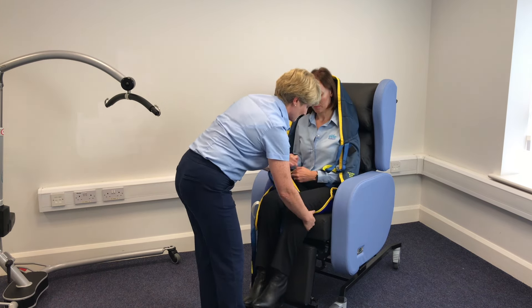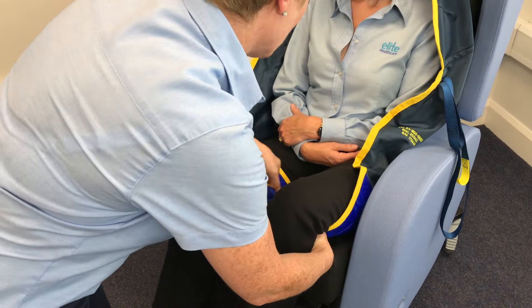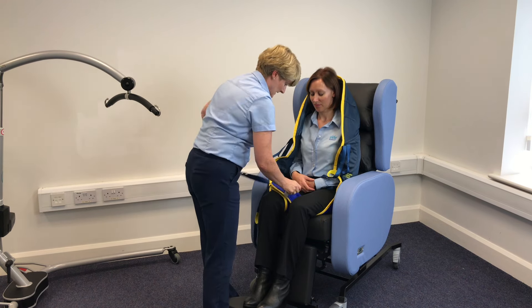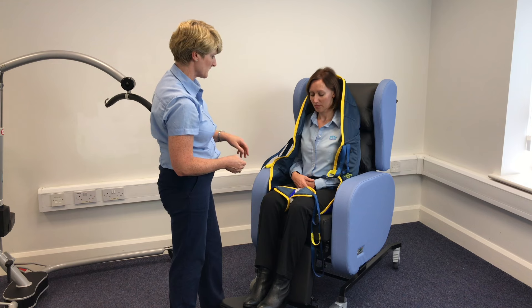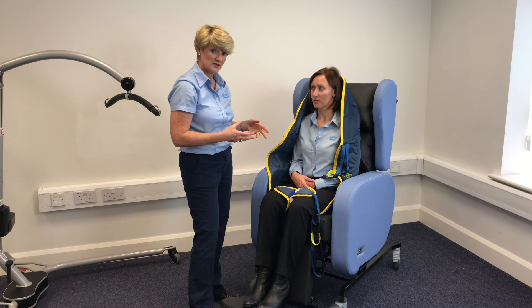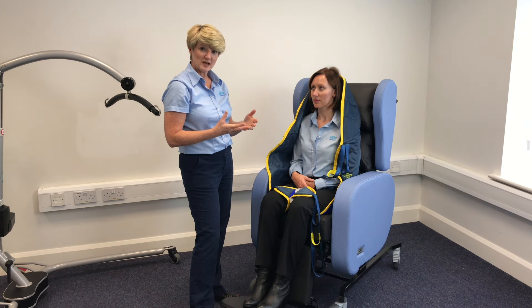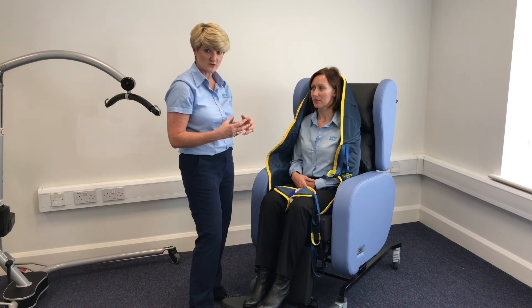Without having to do a major lift with Deirdre's legs, the leg piece just slides under. It is very important that the sling is on symmetrically, because if it's not, the patient is going to end up being twisted. I'm just going to put the leg piece through the modesty strap — if I don't, you end up with too much abduction in the hips, which is not a good idea. This particular sling is a looped system. I find looped systems a lot better, particularly for the complex patient — your patient with tight hamstrings, contracted legs, clients that are windswept, maybe bilateral amputees, and of course wriggling children. You have a lot more diversity and range of slings available for those complex types of patients.